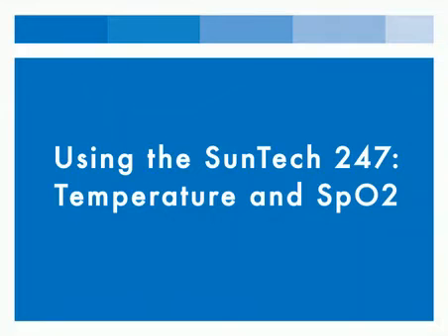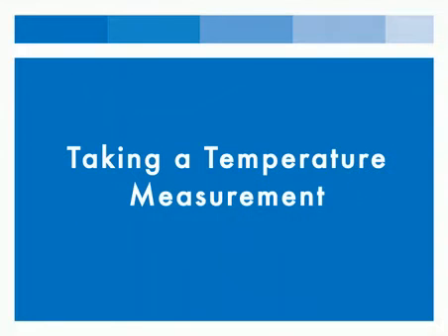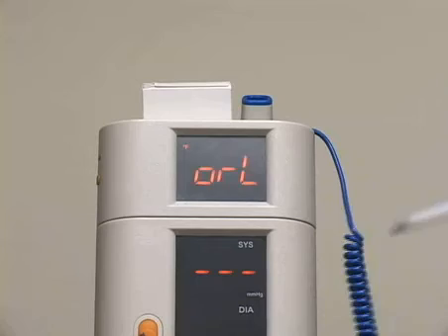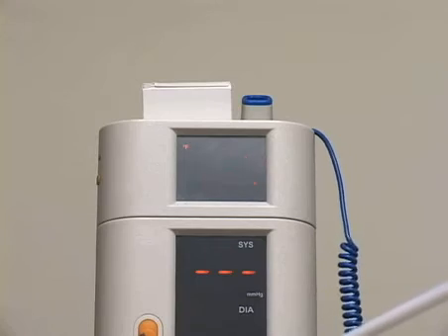In this video, we will show you how to take a temperature and SpO2 measurement. To take a temperature, remove the blue temperature probe from the well and place a disposable cover on the probe. When the device beeps, it is ready for use.